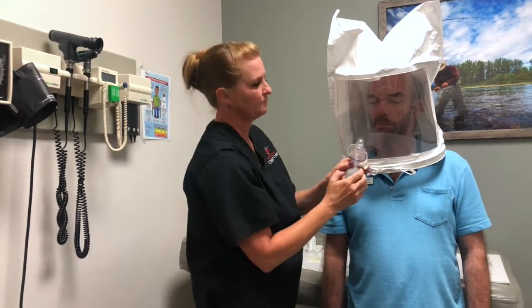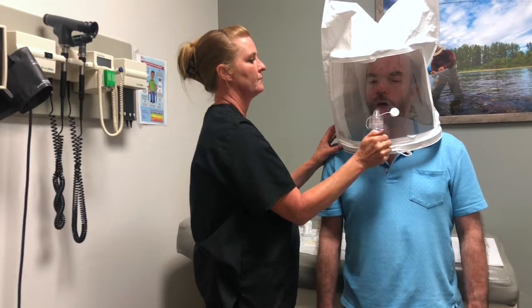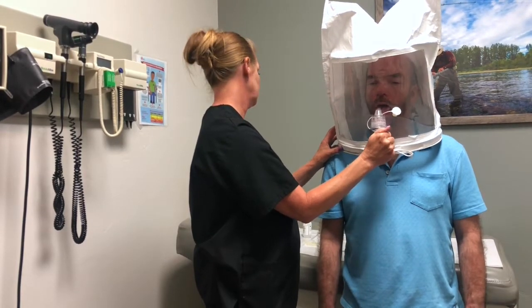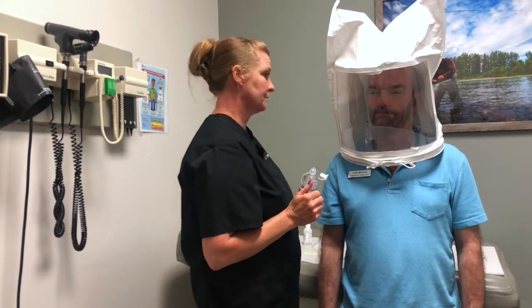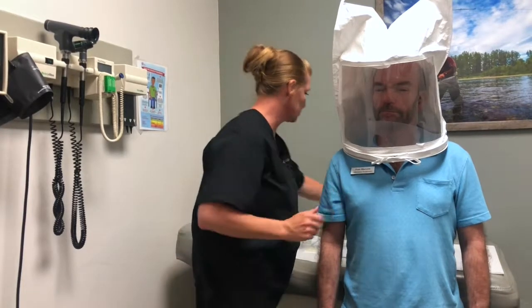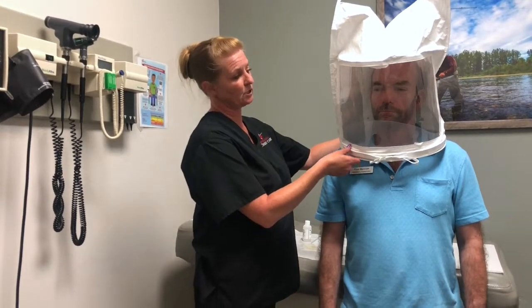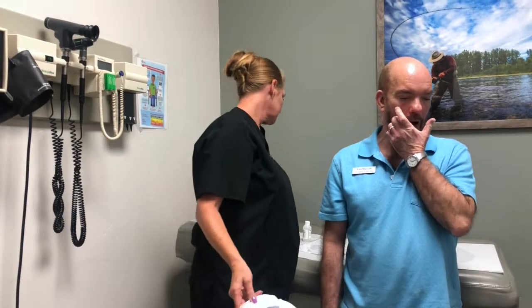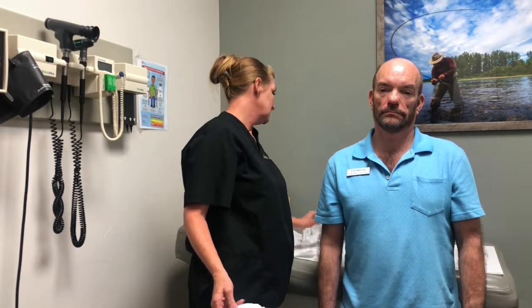Let's try it out. Big breath — tongue out, then just breathe normally. A little bit of taste? That's fine; it doesn't need to be a whole lot. If you can taste a little bit, that's good. We'll put nebulizer number one down. Then you're going to instruct the patient — take off the hood and wait a little bit until their mouth clears. If they need a drink of water to get the taste out, you can give them a drink of water. Remember, you're not in a hurry because you want to make sure the respirators fit properly.